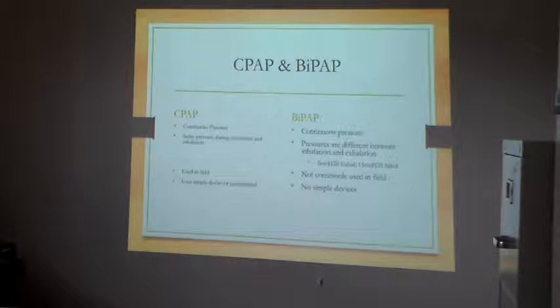BiPAP is not simple at all. You have to change a bunch of settings. It's no different than using what we refer to as an SIMV vent, or one of those specialty ventilators that they use for critical care transport. It's very complicated to set up, okay?